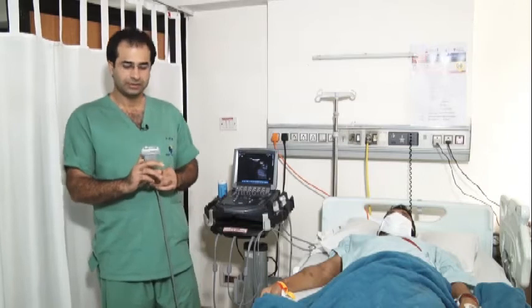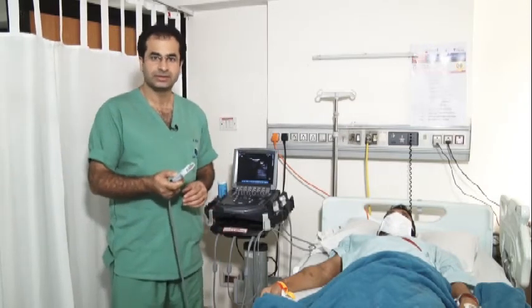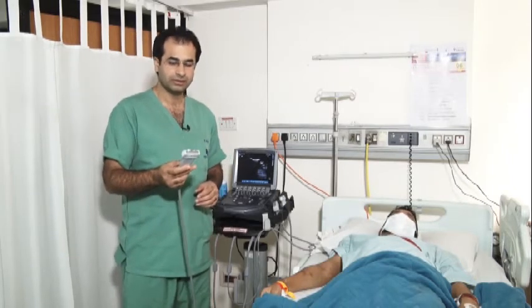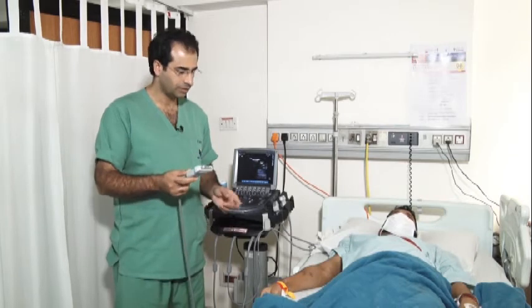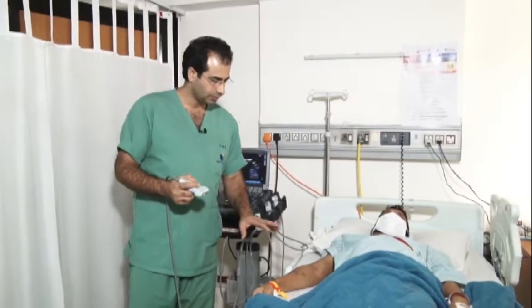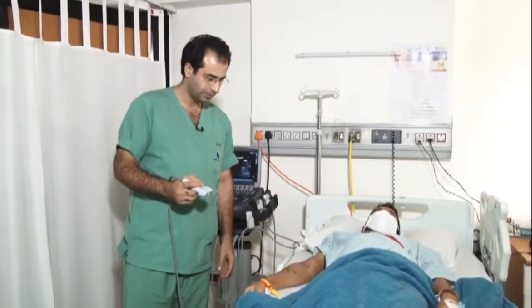I have taken the linear probe. This is the linear probe. Its frequency is 6 to 13 megahertz, so we use this to look at superficial structures. Now the position of the patient is supine, with the arm resting on the bed.